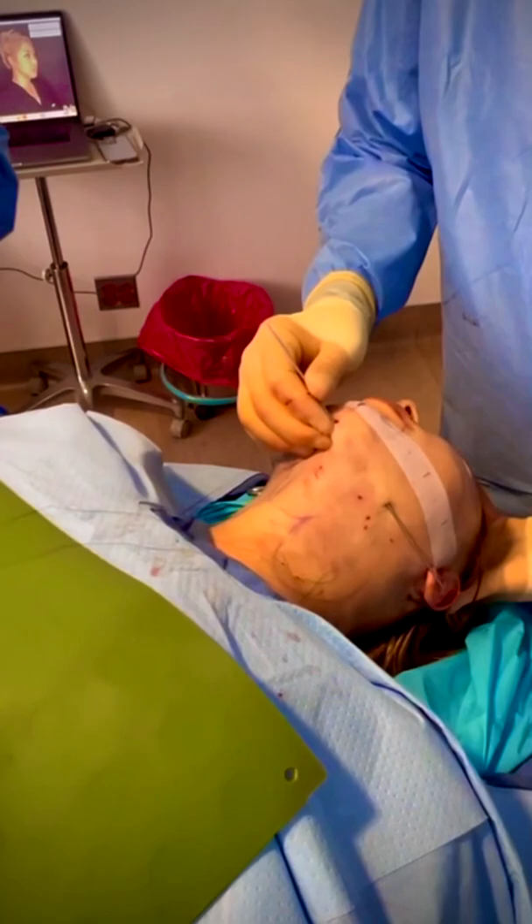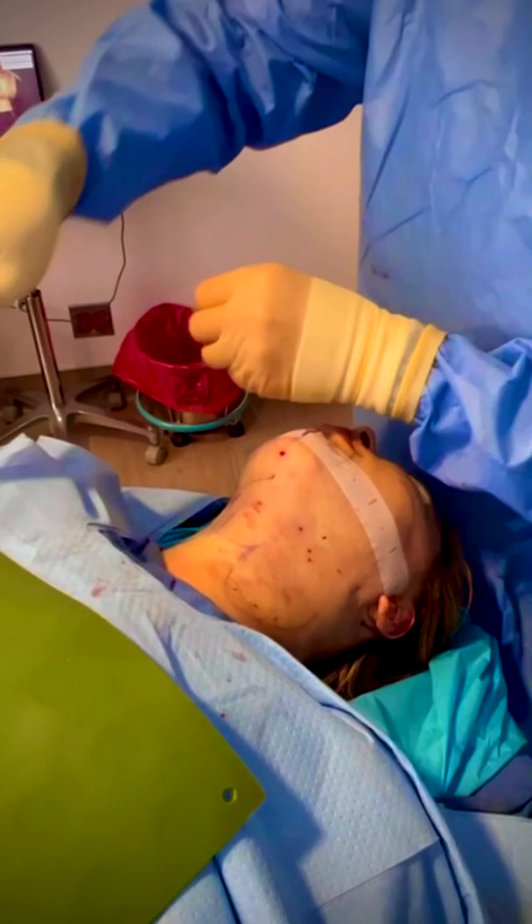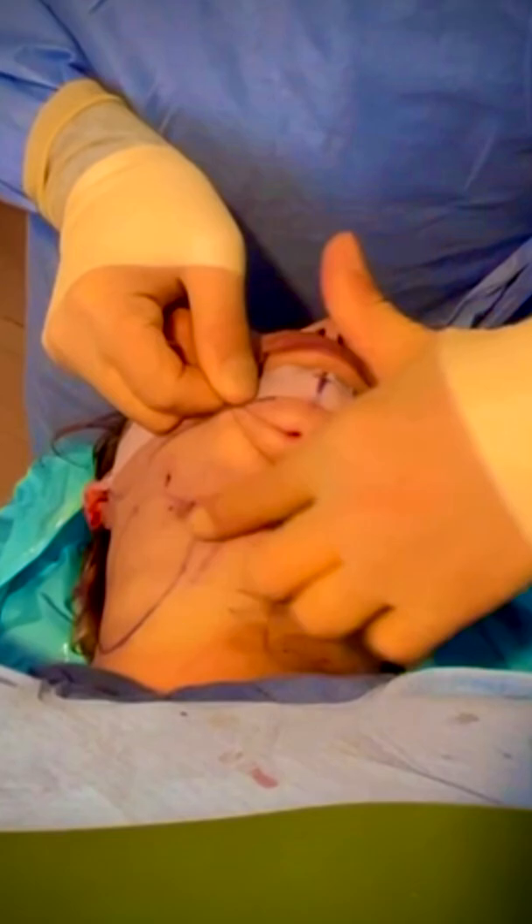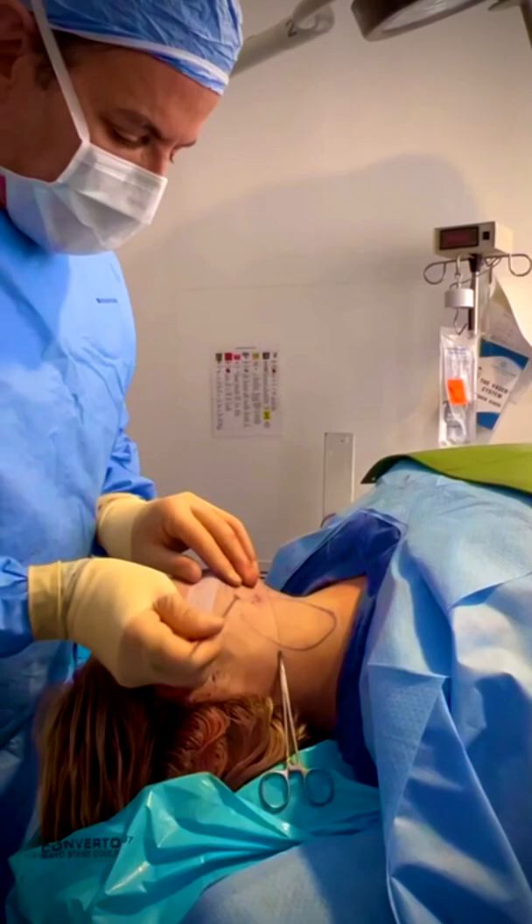I just want to show you here — this is a cool demonstration. If you look at her neck, you can see this side is snatched, which is her left side — that's the side where we have MyElevate placed. And if you look at her right side, it's not done yet. So this is how she would look if she just had lipo alone, and this is how she looks with lipo plus MyElevate. We're going to do the other side — that would be mean if we only did one side. This is all really safe — it's just underneath the skin, safely away from any nerve or blood vessel, which makes it a nice minimally invasive procedure for patients with very low risk.